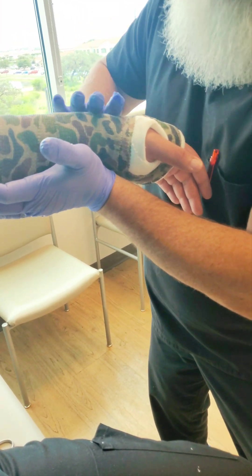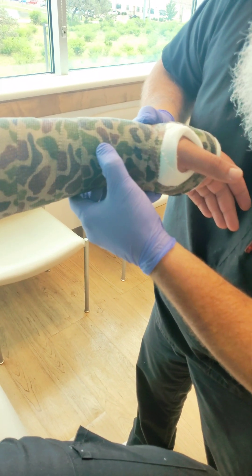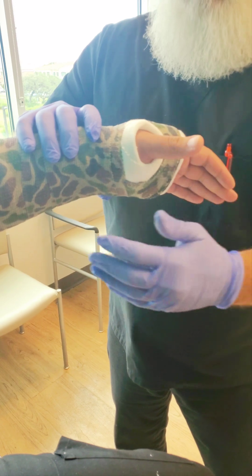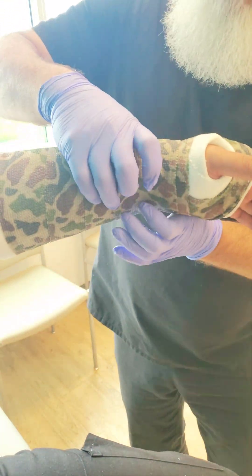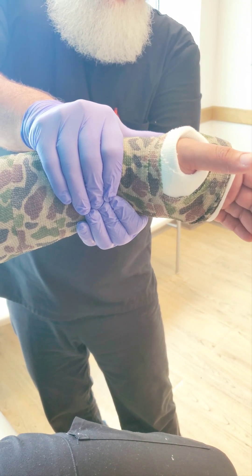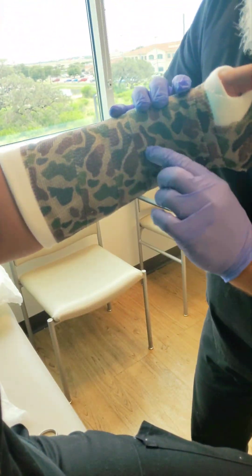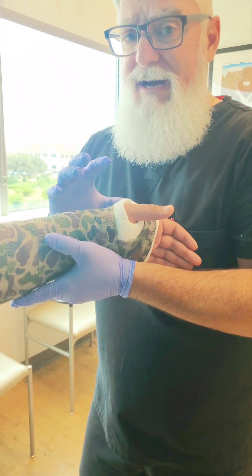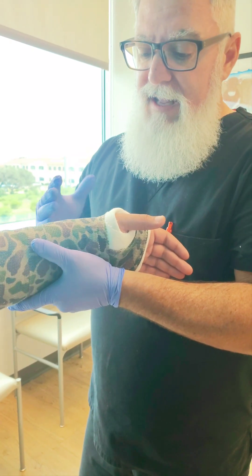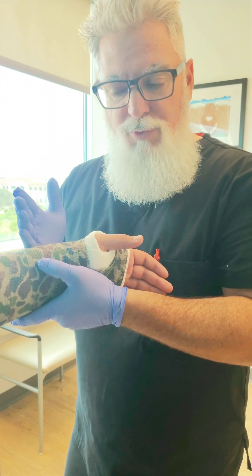Some things to remember when doing this — this is super important: you don't want to do a super hard mold. If you start to see creases, you don't want to compromise circulation, cause numbness, or leave finger indentions in there. If you're using your fingers for leverage, don't press very tightly — keep moving them around. If you leave finger indentions you're creating hot spots, and the patient will come back needing the cast redone, making it look like you don't know how to do a proper mold.